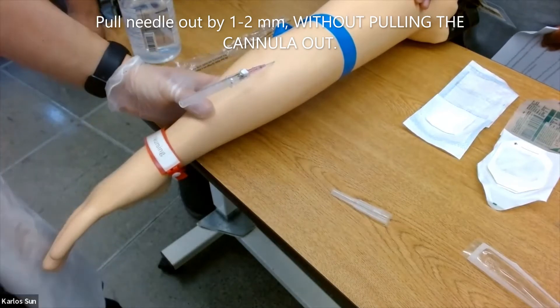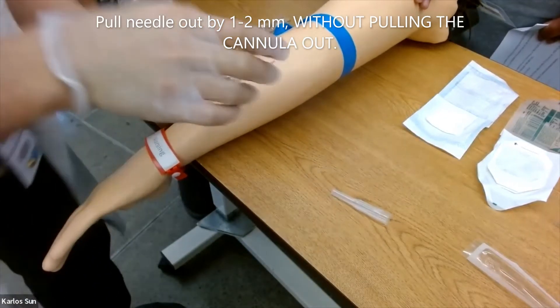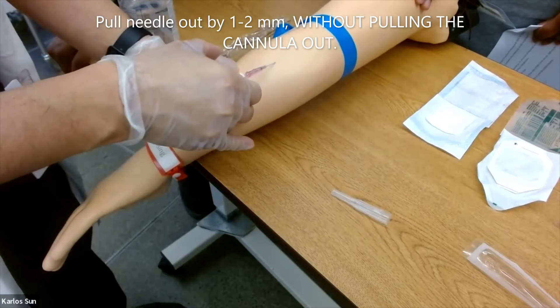Pull the needle slightly out by one to two millimeters without pulling the cannula out.